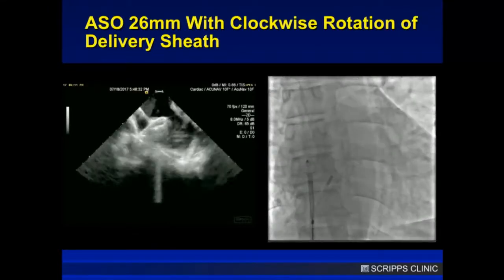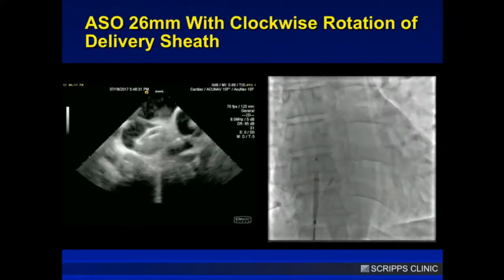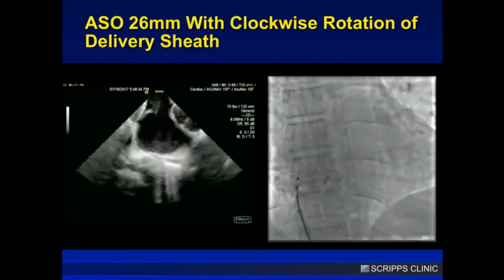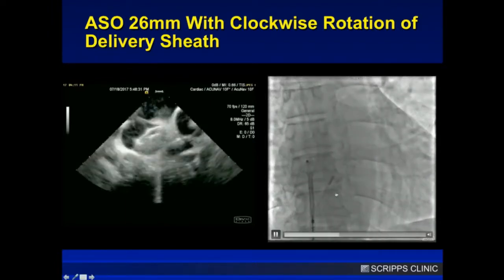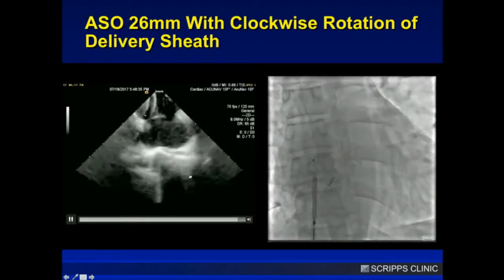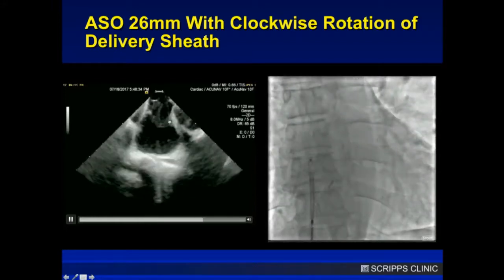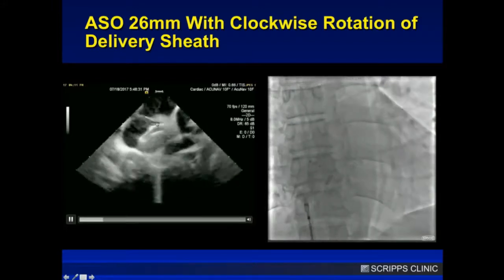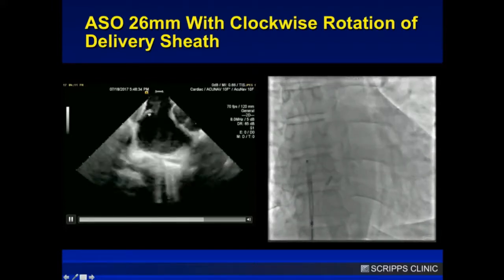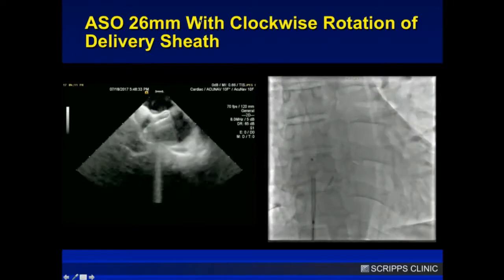I'm doing this by intracardiac Echo. I went off the bat with clockwise rotation — you can see I'm straight up and down on the fluoro, just how I want to be. But it just falls right through. Number one, I'm still not quite orthogonal to the septum. Number two, it's very floppy — you can see I'm pushing the septum all the way out. So clockwise rotation doesn't work here.